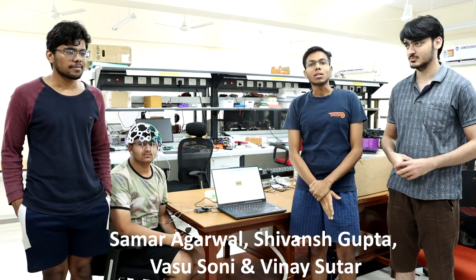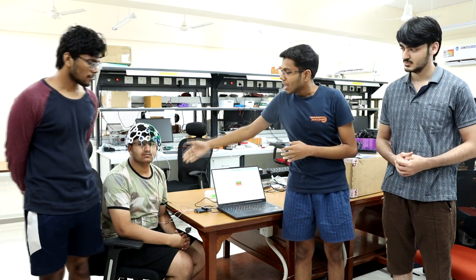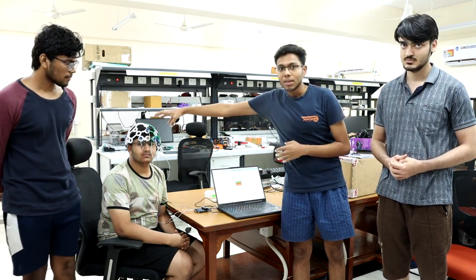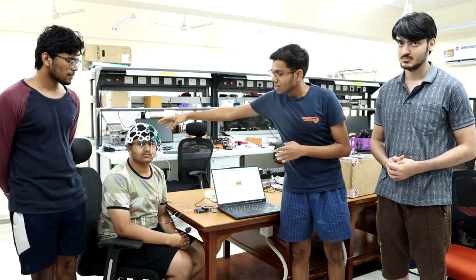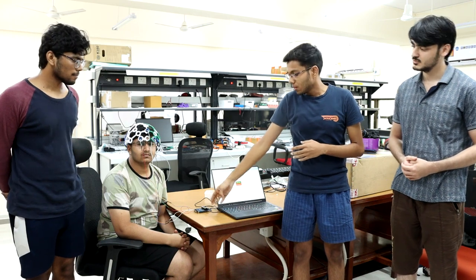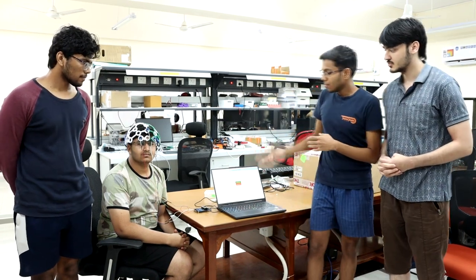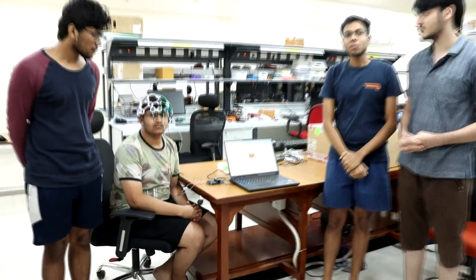We have worked on our project Neurotrack, which is basically a 16-channel EEG recording system. This is a test subject with a 3D printed headset from which electrodes are coming to our PCB, which collects and processes the data, and finally we visualize the data on our laptop.